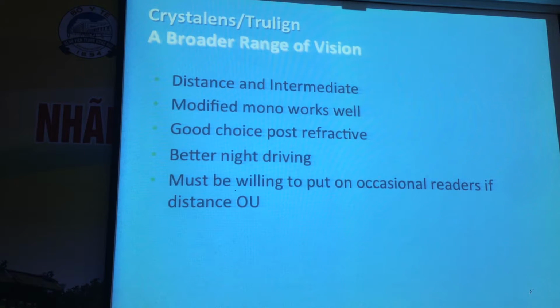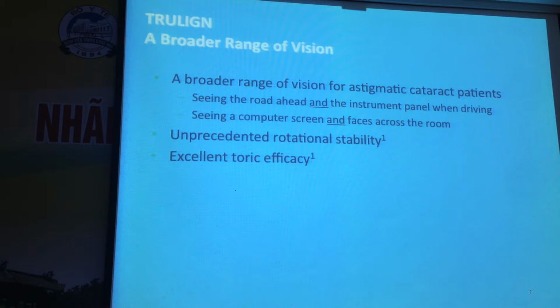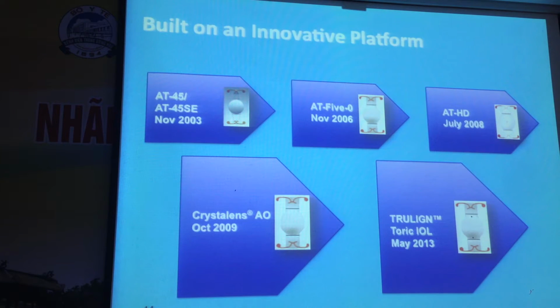It's very important that the patient doesn't mind not having to read. They call it a broader range of vision, and I think that your Symphony lens is going to be much more like that, the type of lens that we have. From everything I understand, you guys might be able to tell me better, but that's a lens that's going to be very good for distance and very good for intermediate. My patients are very happy with that for the most part, especially the male patients. Female patients sometimes want a little bit more reading, so it has to be taken under consideration. But the toric lens in this situation for astigmatism is very, very successful.